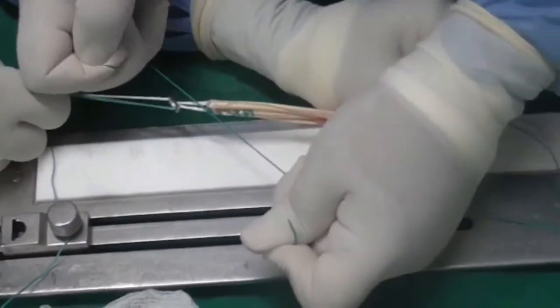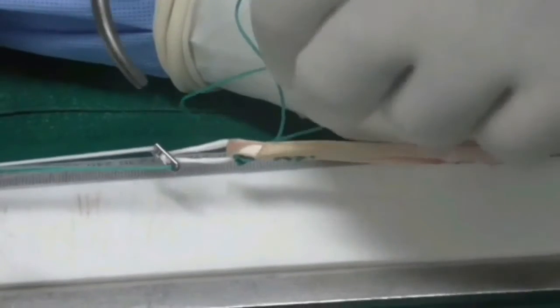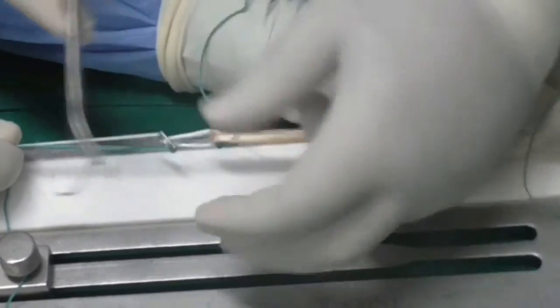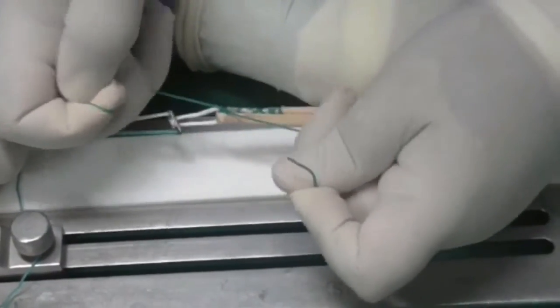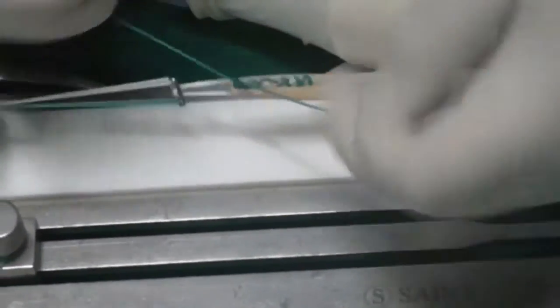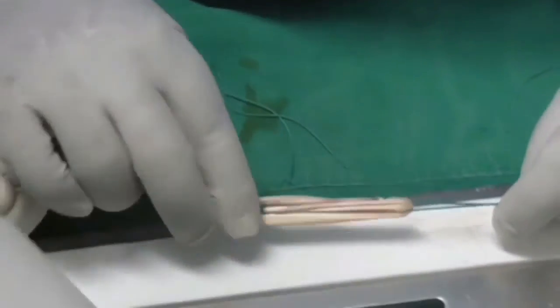Making two knots on only one side may not be enough, so now we take both sutures through the loop to the other side. Once they come through from the other side, we pass them through the loop of the endobutton again and make another two to three knots on the other side. We add one more knot, then cut the ethibond suture, and our graft is ready to be passed.